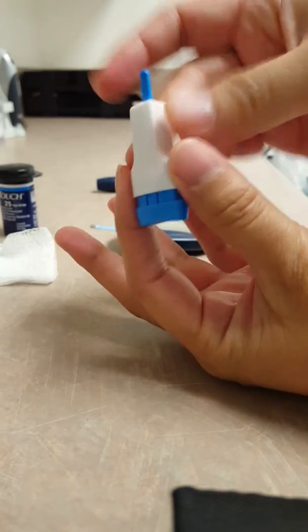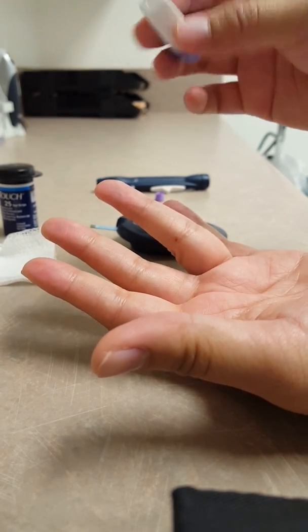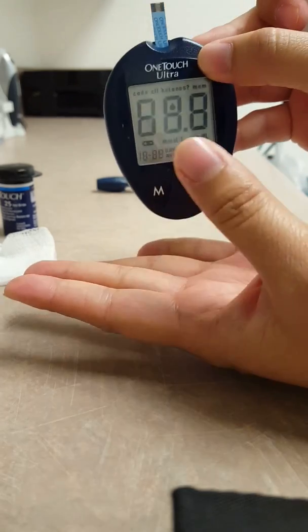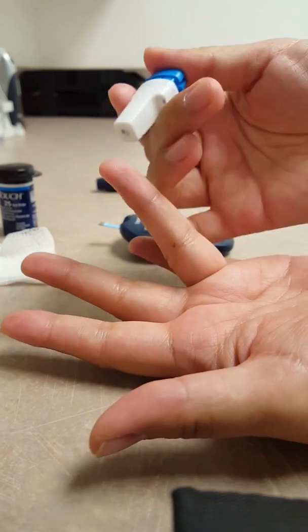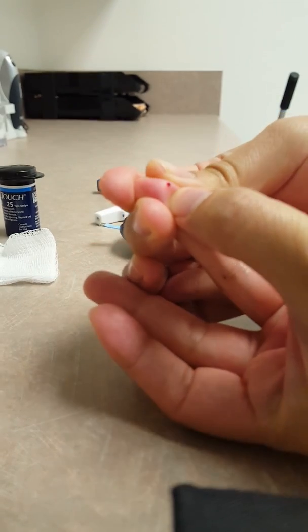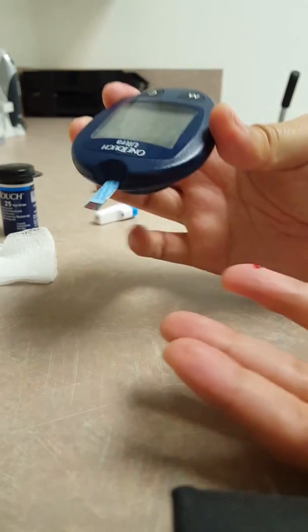With your single-use lancet device you are going to twist off the top — it'll look something similar to this possibly — and then the top is where the needle will come out through. So now that I'm ready, I'm going to insert the strip fully, turn the glucometer on, and then you will wait until you see the sign that says it's ready for a drop of blood. Going to prick your finger. Okay, so there's a drop of blood, I just need a little bit more blood. Once you have a good drop of blood, angle your glucometer down and the blood will go up and it starts counting down.